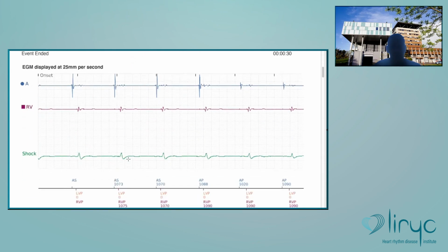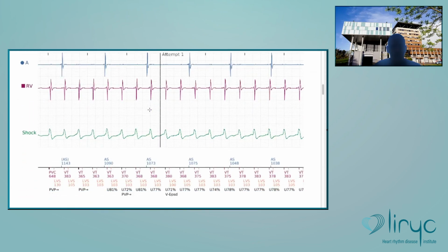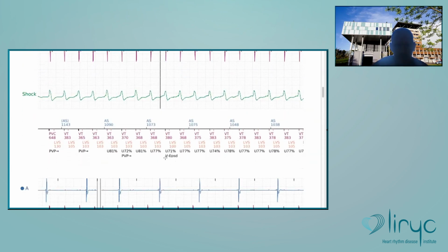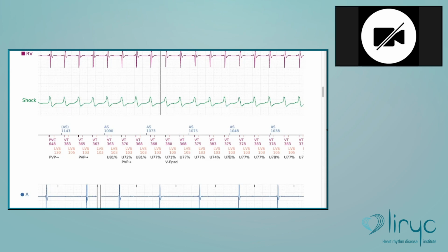So now if you have a look, it's a dual chamber ICD. No, it's a triple chamber, sorry. And you see here, clearly, ventricular rate faster. That's a real VT, no doubt. 8 out of 10. You see here the percentage. It's not 0% here, but it's less than the threshold that I've shown you of 83%. You remember? Of course, it's less than 94%, but it's also less than 83%.